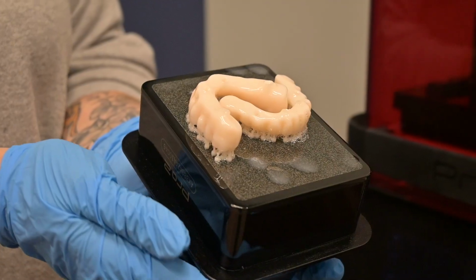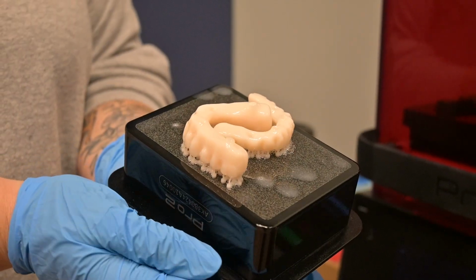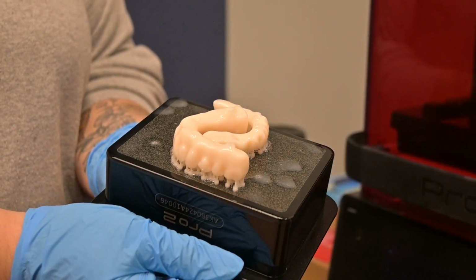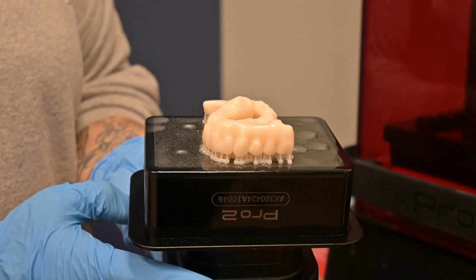So the whole process may take up to 3 hours, maybe 4 hours in general, but the surgical part is the faster one, because it's the one that we do first, and after that we just have to wait for the provisional to be printed, and so we can place it, and that's it.